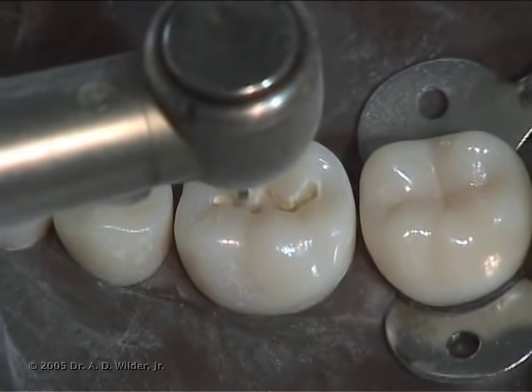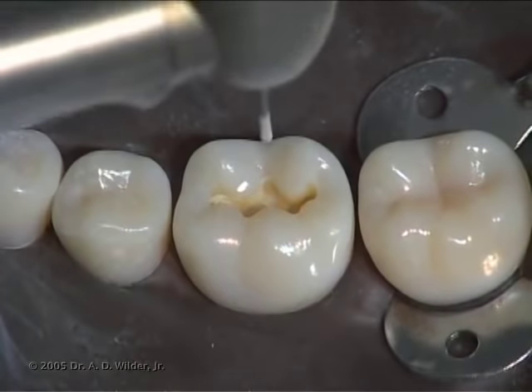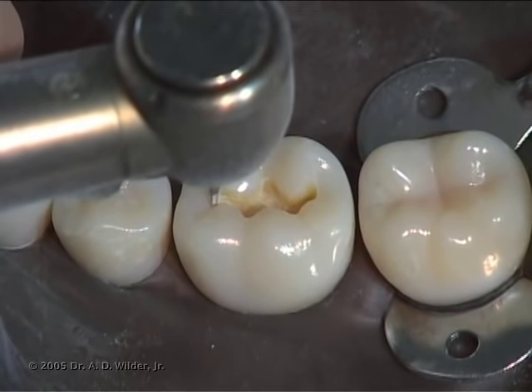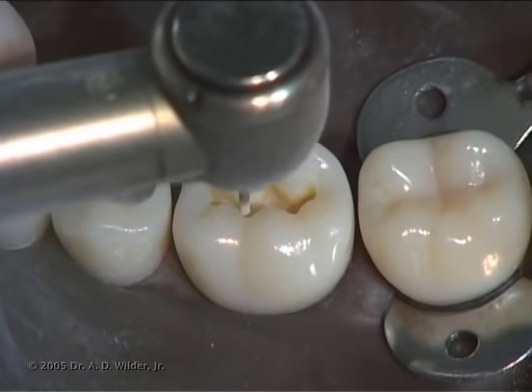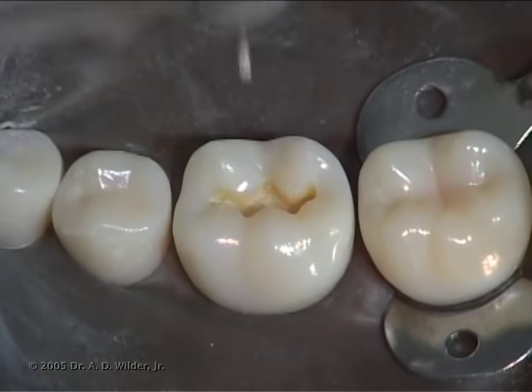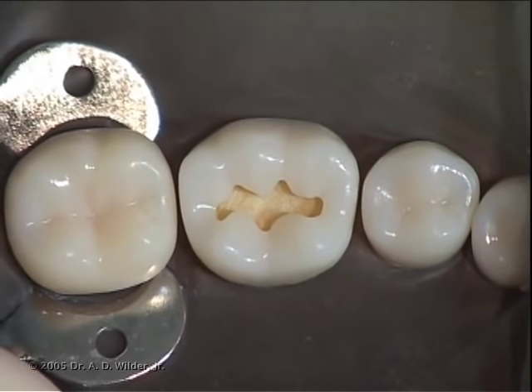This will put you just inside the dentin layer on an average occlusal surface. Extend mesial and distal and buccal and lingual along the natural grooves of the tooth to incorporate the extent of disease until you reach sound tooth structure at the perimeter of your preparation. Ensure that the walls are smooth and rounded. From an occlusal view, verify that your preparation walls converge towards the occlusal surface.